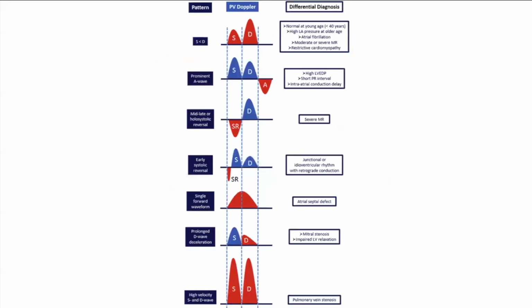This is another printed slide for people who like summaries. This is the one I just showed, ASD. It's good to look at when you have waveforms. And then that's it for me.